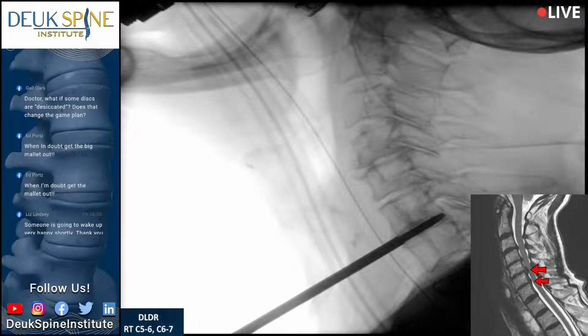Yeah, we can do a little inline traction to help, a little shoulder pull, a little arm pull, and inline traction, just straight inline traction with slight extension. When you guys are ready. Slowly. Not too much, just a little bit. All right.